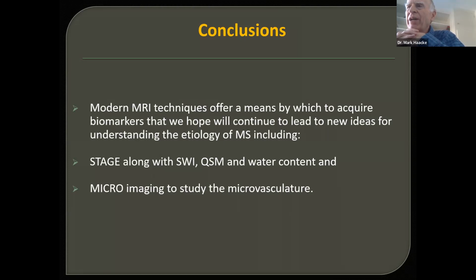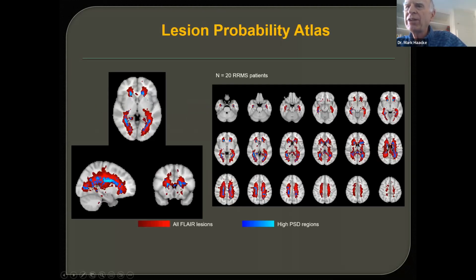We're actually quite excited to start to do that so that we can compare what is the normal flow in healthy controls versus what is the flow in the ependymal veins, especially for those patients that show a lot of white matter hyperintensities in this region right here. So if you can still see my slides, you see this thin blue strip? Yeah.